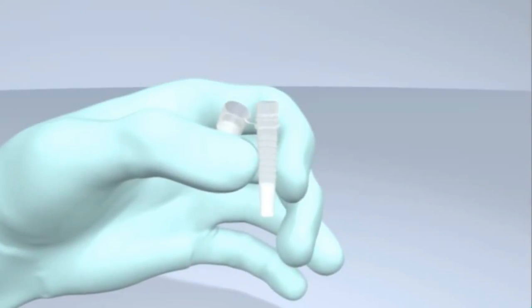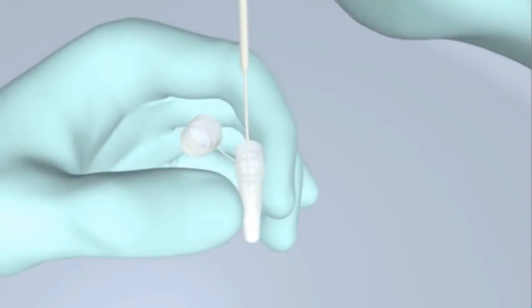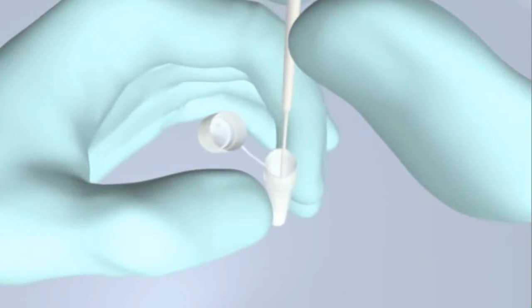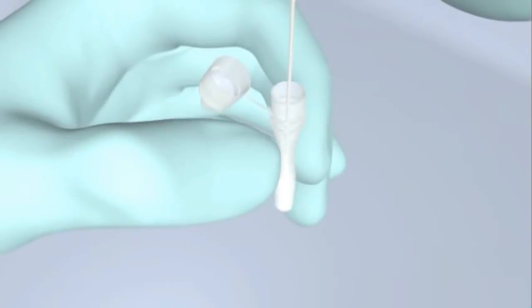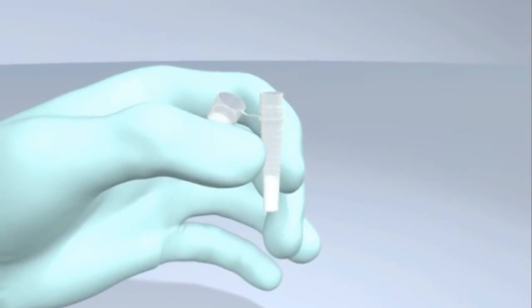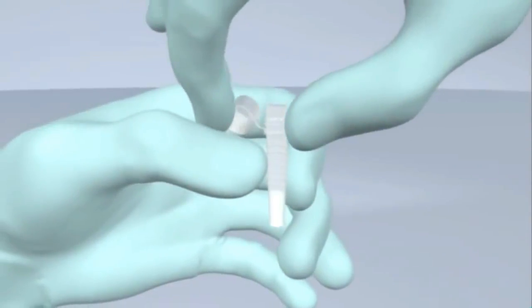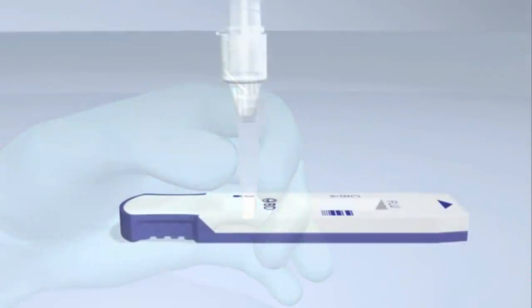Fully insert the swab into the unitized tube, ensuring that it is immersed in the liquid process reagent, and swirl it along the inside wall 3 times to release the specimen. Remove the swab while squeezing the middle of the tube to capture the optimum amount of sample in the processing tube. Snap fit the tip onto the unitized tube containing the processed specimen. Threading or twisting is not required.